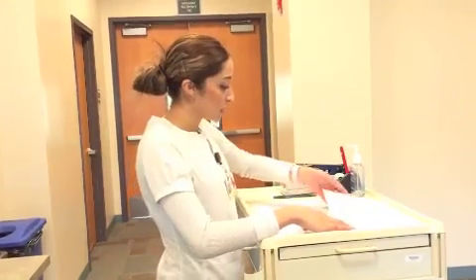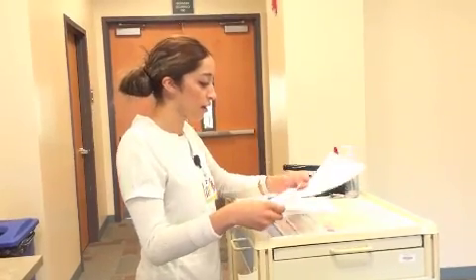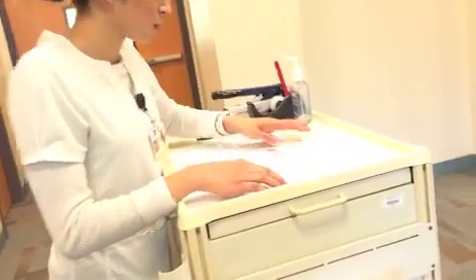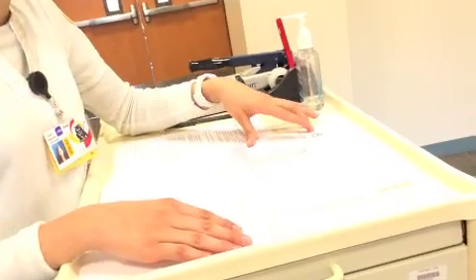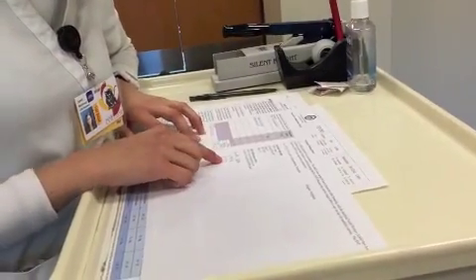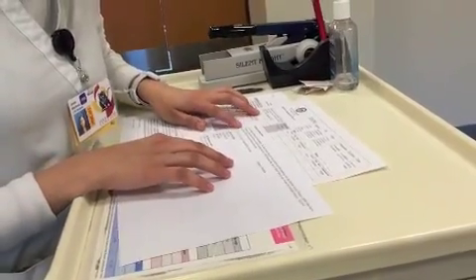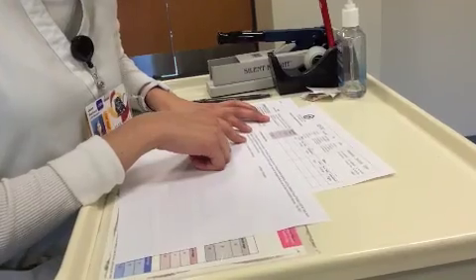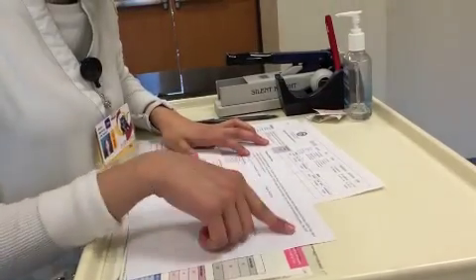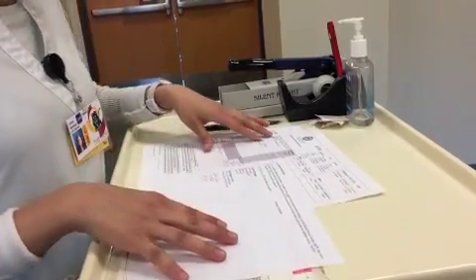So what you want to do is compare and verify that you have the order and that it's correct. You want to do the 5 rights, which is the right patient, right drug, right dose, right route, and right time. So we have Smith, Clara, and the ID numbers match. It says PPD to be administered 0.1 milliliters intradermal now. And the physician's order says require the PPD ID skin test. So they match.